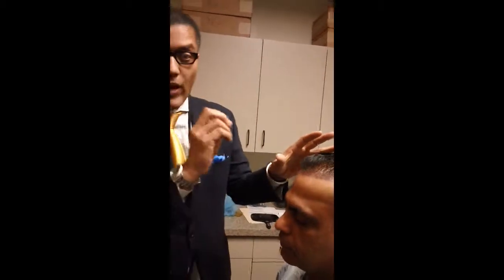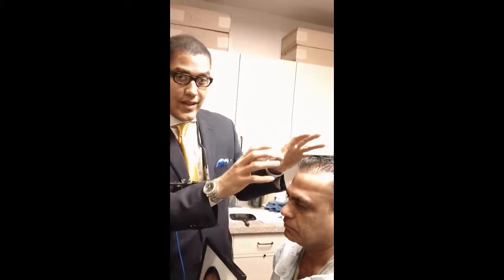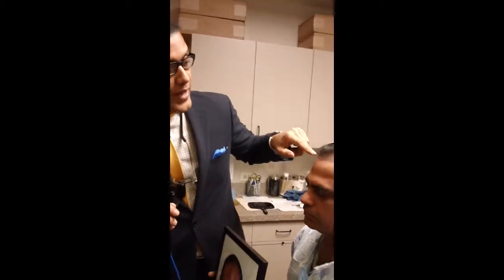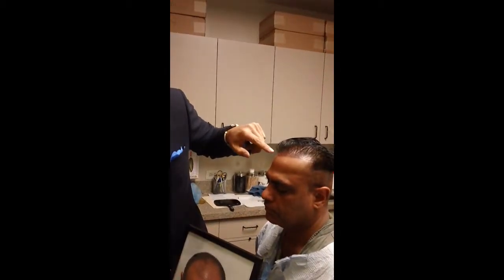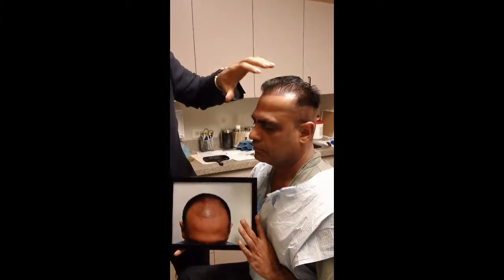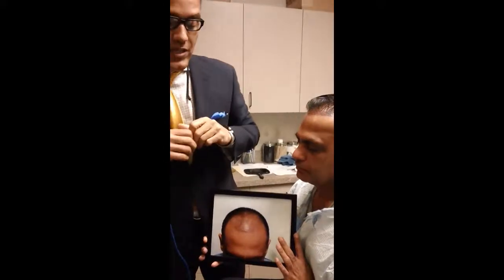Now you must remember his hair is wet now, so when his hair is dry it's going to look twice as thick. It's wet now, so this is the thinnest his hair looks. Trust me, when his hair is dry it looks quite thick and quite dense. So we added a thousand grafts right in front of the hairline here with one hairs and two hairs just to kind of make this even more — give it more pop so it stands out.